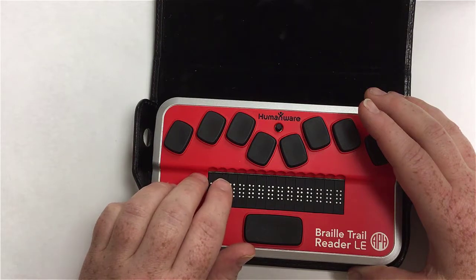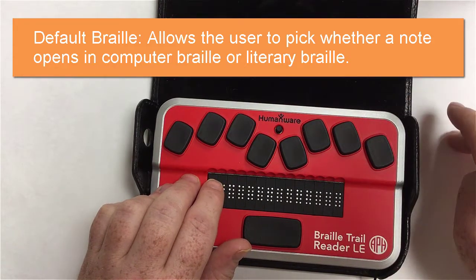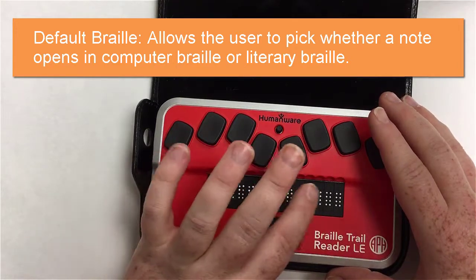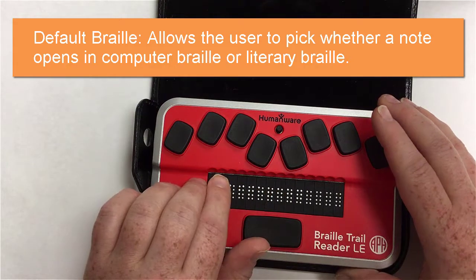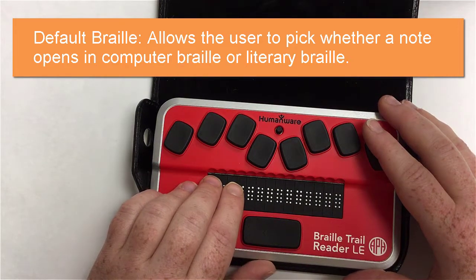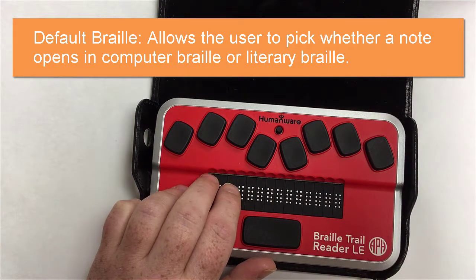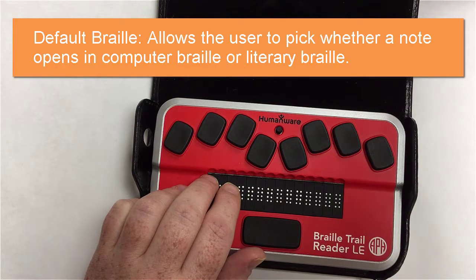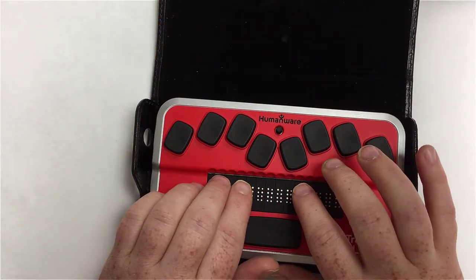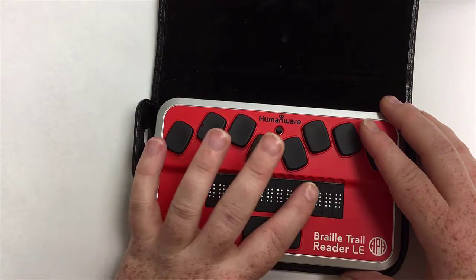The next item is default Braille. This allows the user to pick whether, when you open a note, it should be in literary Braille or computer Braille. Right now the full cell is next to literary Braille. You can switch between the two — if you're less proficient in Braille you might choose computer Braille, but most Braille display users will want literary. I'll hit backspace without changing it.